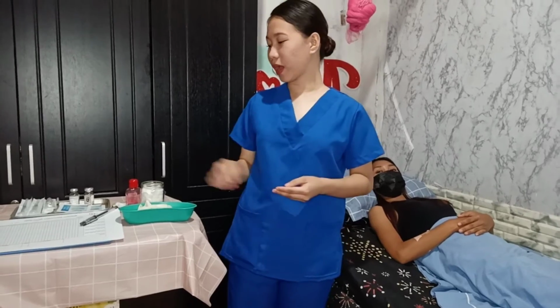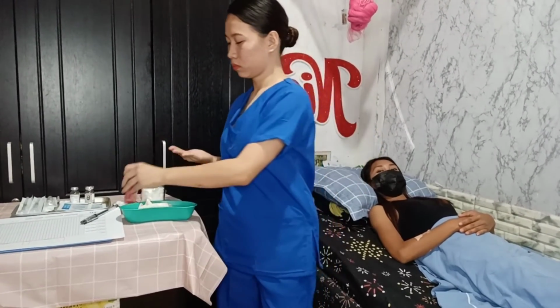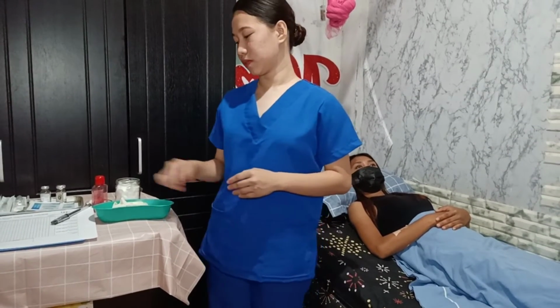Then, perform hand hygiene. Next, select and clean the site. Select a site, avoiding sites that are tender, inflamed, or swollen, and those that have lesions. Put the gloves on as indicated by agency policy.